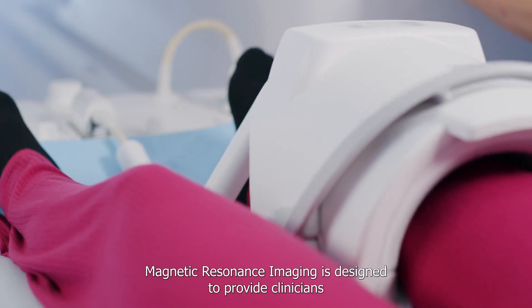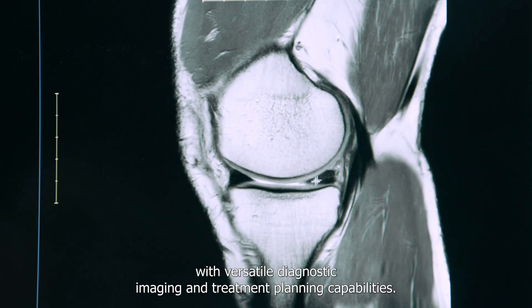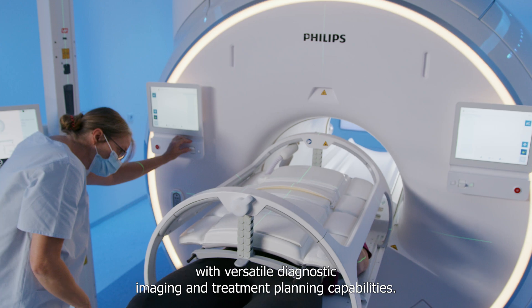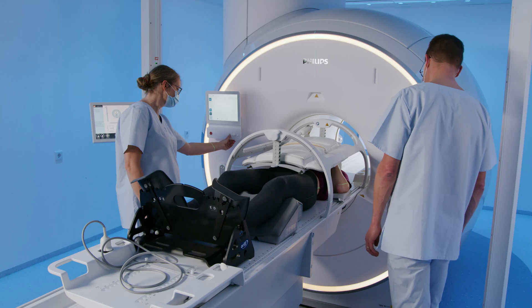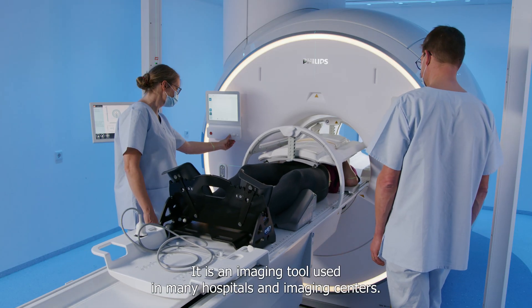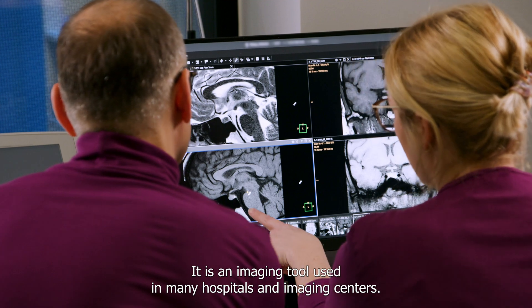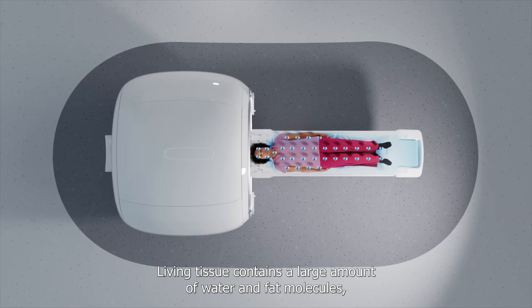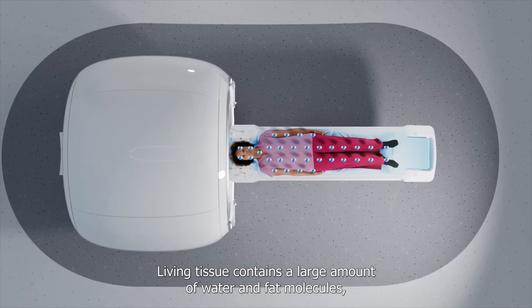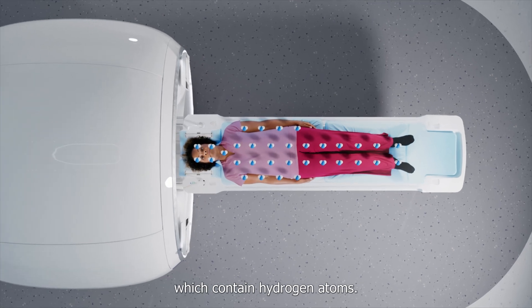Magnetic resonance imaging is designed to provide clinicians with versatile diagnostic imaging and treatment planning capabilities. It is an imaging tool used in many hospitals and imaging centers. Living tissue contains large amounts of water and fat molecules which contain hydrogen atoms.